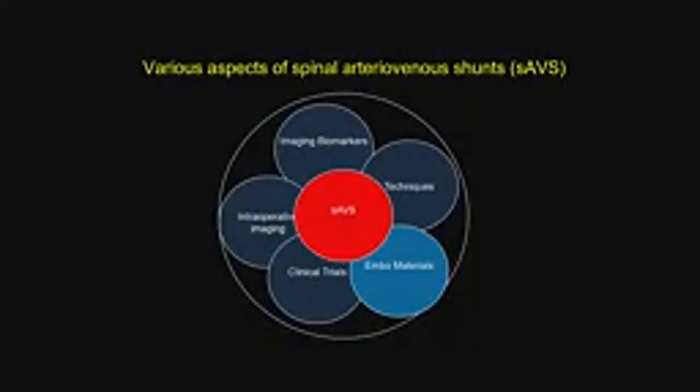First of all, it's important to understand the anatomy, and you heard from Dr. Kosher to separate veins from arteries. It sounds simple in the brain, but in the spinal cord, it's not easy. I will show you a case where it's really difficult to separate that, especially when the shunt is tremendously high. The other important thing is to use intraoperative imaging. You see from the discussions, cone beam CT and MRI will help you a lot to understand that. Then embolic materials: we have at least 3-4 different ones. I don't use Onyx for spine, and I can tell you why in a slide shortly.